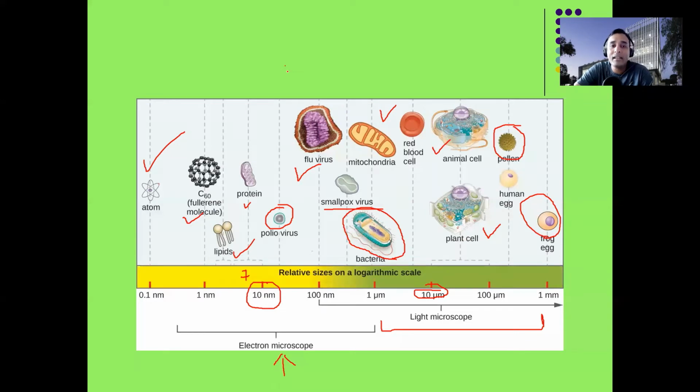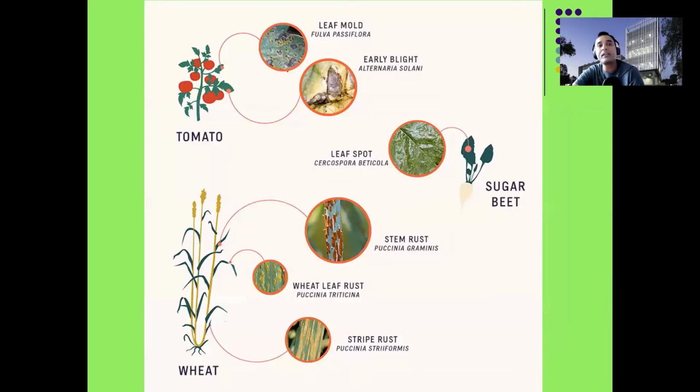Okay. So basically, these microorganisms are not welcome at all in the tissue culture lab. There is a wide variety of pathogens. Whether it is a pathogen or not a pathogen, you don't want either of them. Neither pathogen nor microorganism. You don't want them in a tissue culture lab, because if you are doing something in vitro, it definitely has to be free from viruses, right? That is why we use meristematic tissue, which does not have a vascular system, to produce plants that can guarantee the absence of viruses, right?